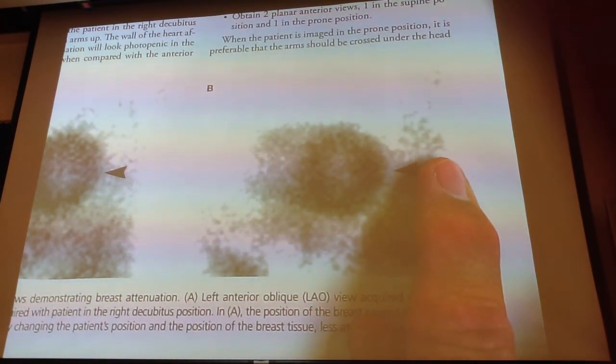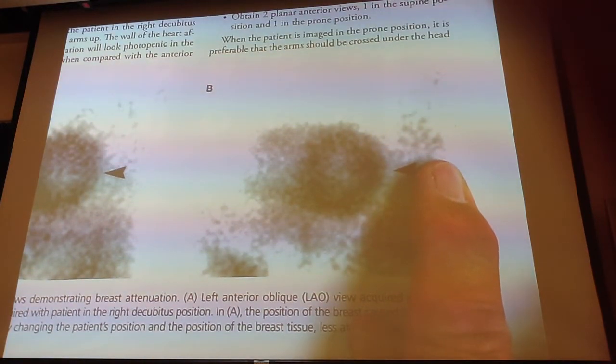You're supposed to draw a region of interest around your composite image, when you're assigning where the apex is and everything. You're supposed to measure the number of counts, and I should have 3 times more counts in the second set of pictures than in the first set of pictures. Does that make sense? Because the dose is more. So if I don't, that means that part of my dose didn't get to the heart. It's just a comparison type of thing.